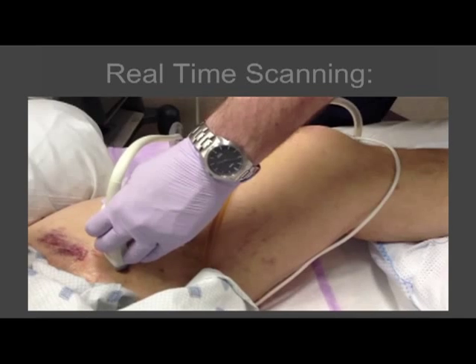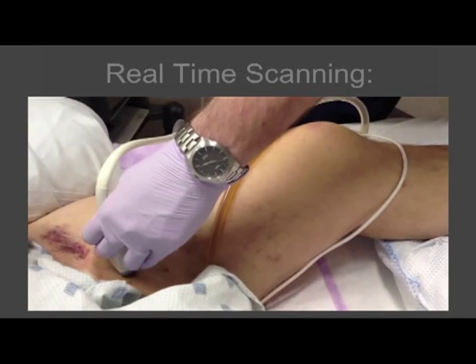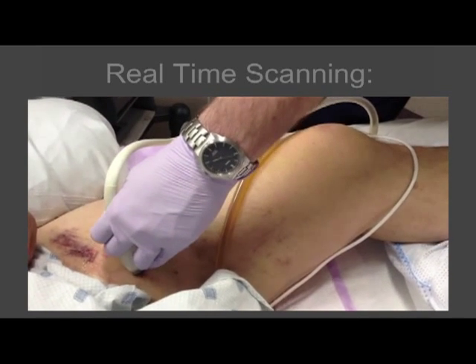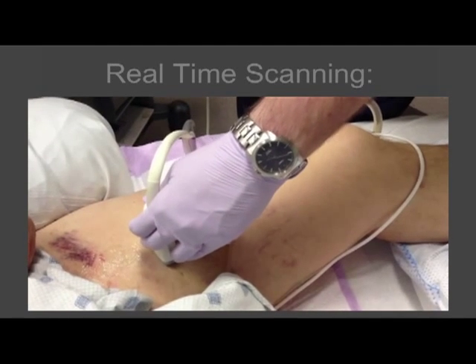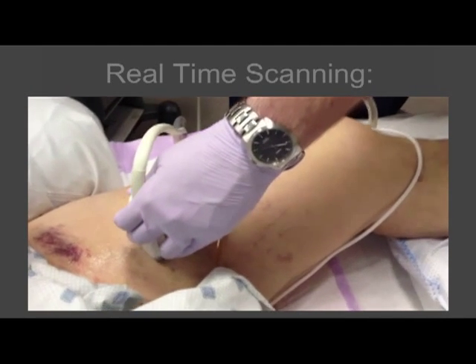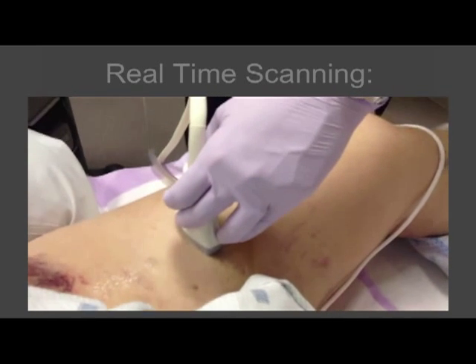Here, I am demonstrating the technique to scan the common femoral vein and follow it distally as it becomes the superficial femoral vein, still part of the deep venous system, and compress along the way.